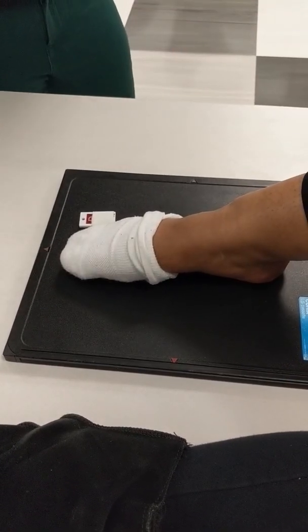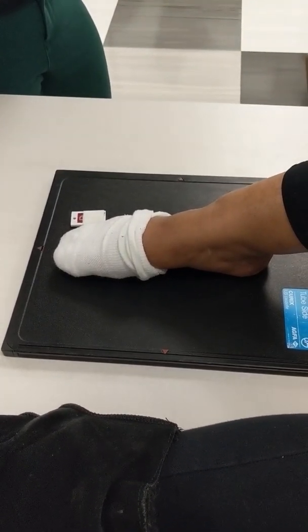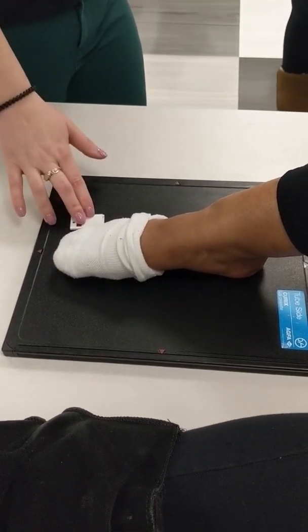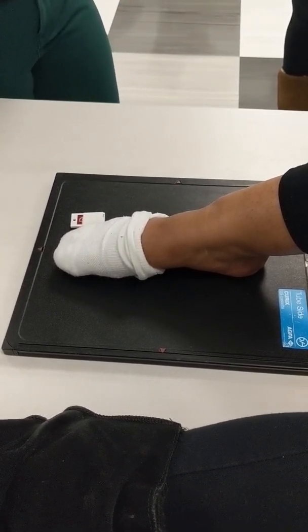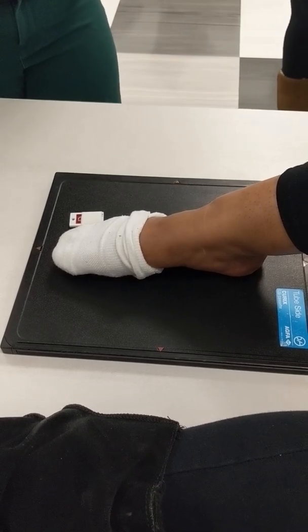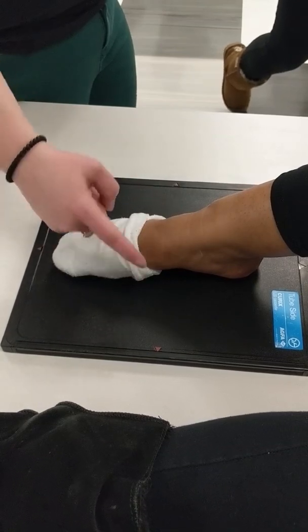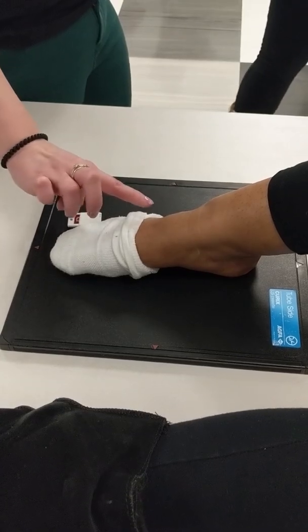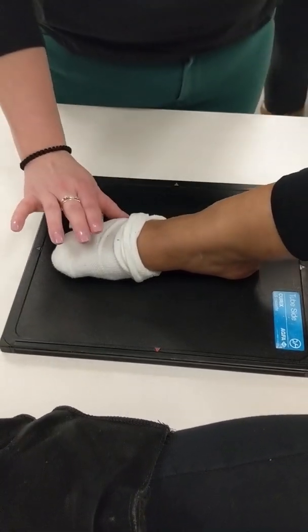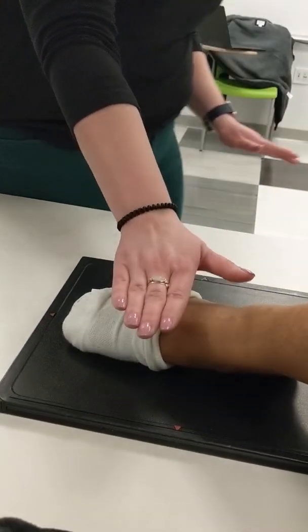Medial oblique for the foot. We have our 10 by 12 still. We've changed our SID back to 40 because there's no tube angle, okay? We've got our right marker on here still, and we need to internally rotate how much? 30 to 40 degrees. If you notice the arch of your foot here, on this lateral side, it kind of flattens out. So what we want to do is actually internally rotate until this dorsal part of your foot becomes parallel with the IR.